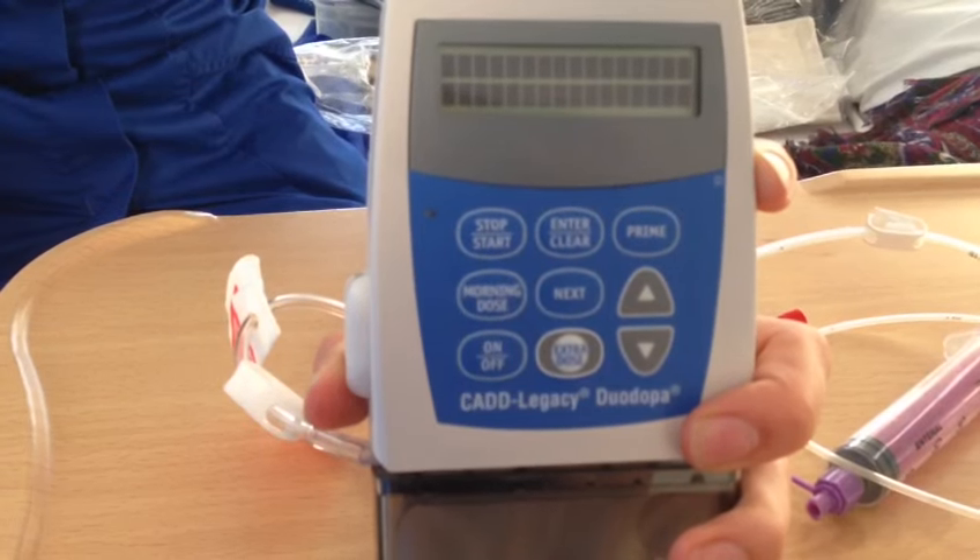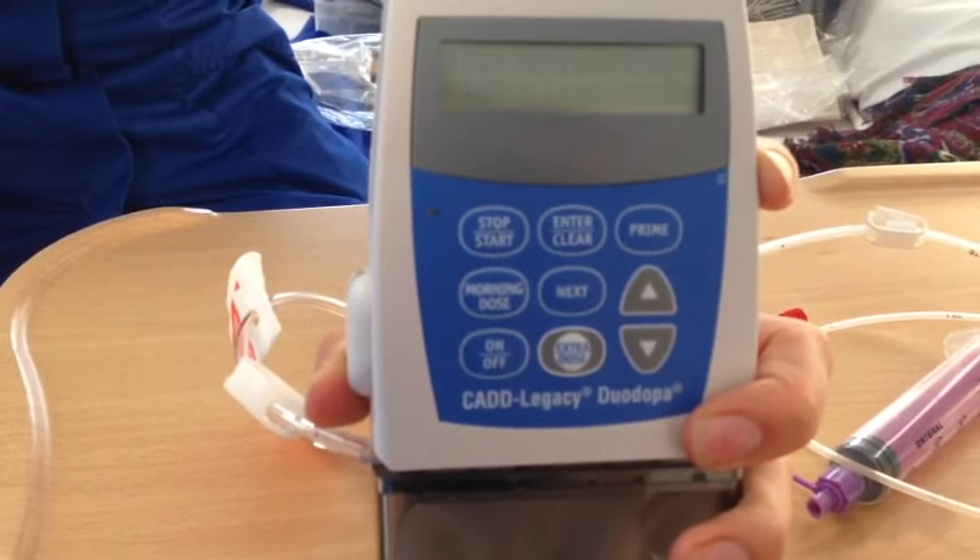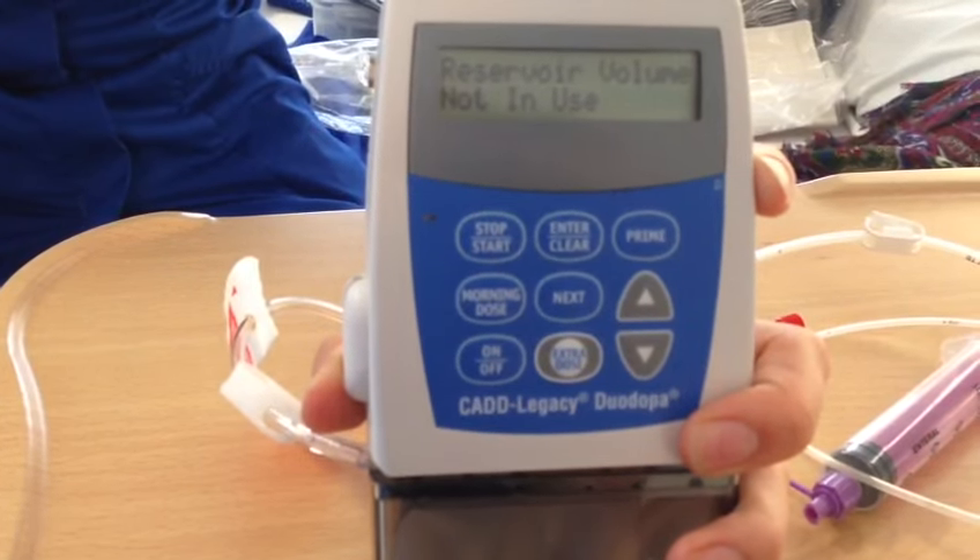Then press on with me. I'm just going to run this other side of the tube.